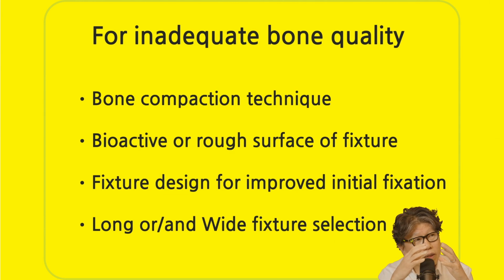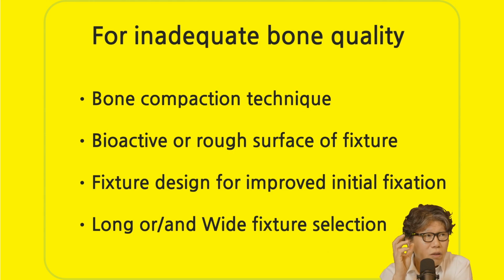The cancellous bone is weak, but in the case of the sinus floor or mandible, there's the mandibular lingual, the mylohyoid ridge of the superficial lingual, and then there's the cortical bone. And for anterior teeth, you've got the nasal rim, then the hard bones on the canine fossa. And then for maxillary first premolars, if you think about it, you have the maxillary sinus wall, the anterior wall, in the sinus cavity. So I use that, and then maxillary 7, I use a lot of cortical anchorage on the posterior wall in the maxillary sinus.